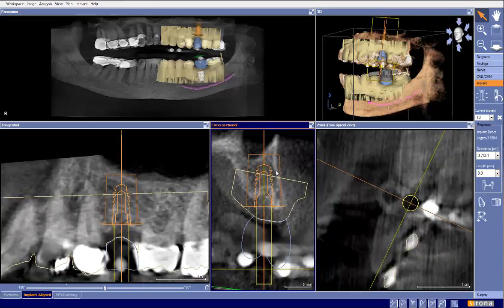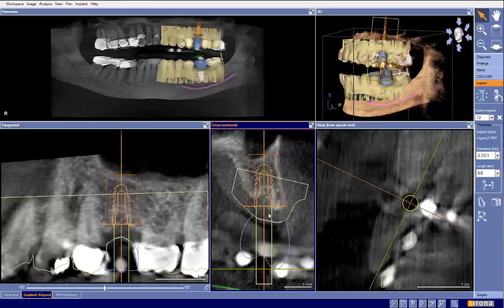There is some chance, depending on the softness of the bone, how much we can expand this socket, the osteotomy, how thin this will be right there, will we have some show through? If anything, we could cheat a little bit here, like so, and know that our implant will be slightly off angle. Instead of coming through the central groove, we'll be coming up the buccal incline, which isn't the end of the world. Maybe we could cheat back a little bit here.